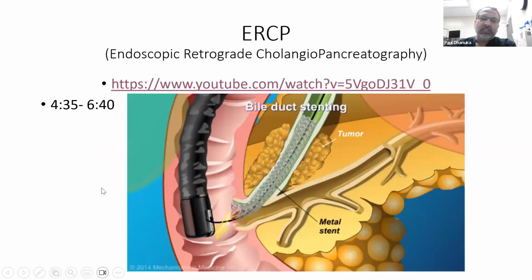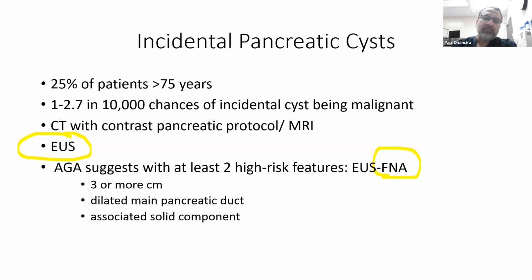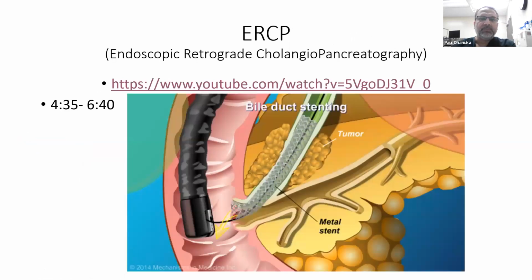You can also put a needle in the cyst and take some tissue, but tissue is generally absent because they're fluid filled, and you can check the CEA level. If that's high, it's suggestive of pre-malignant, but not malignant.